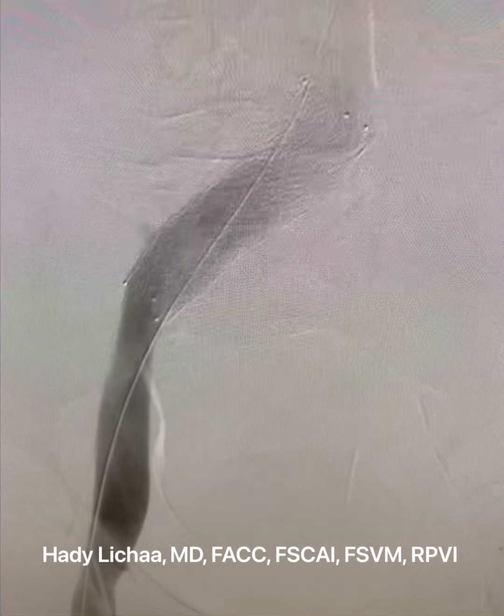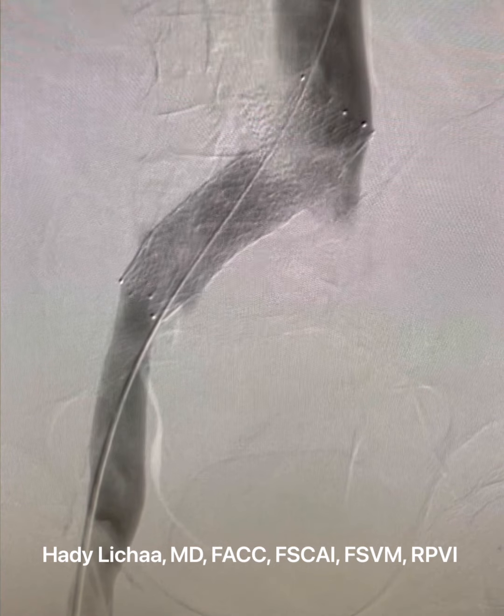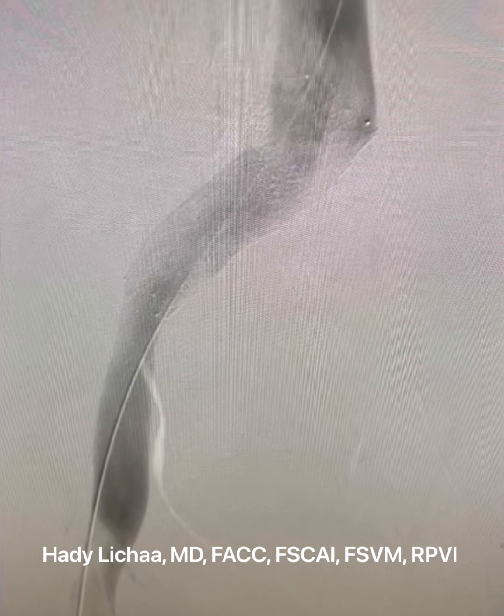It covers the entire compression site without worries about the jailing of the contralateral common iliac vein given the large stent interstices. Notice the improvement of the reflux into the internal iliac vein.